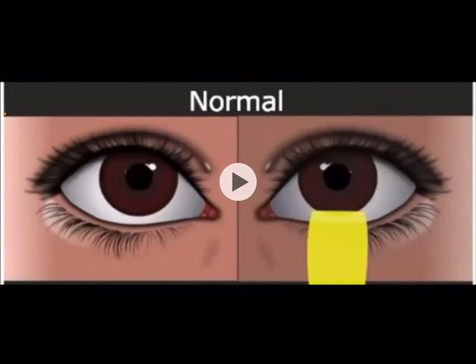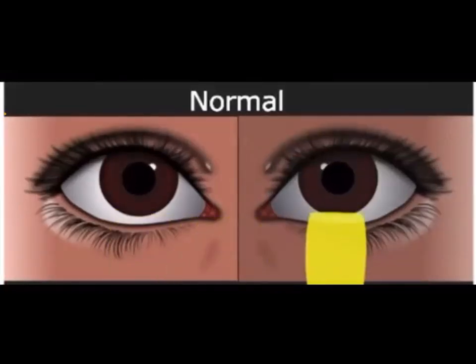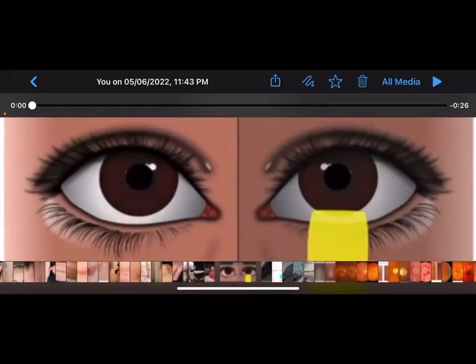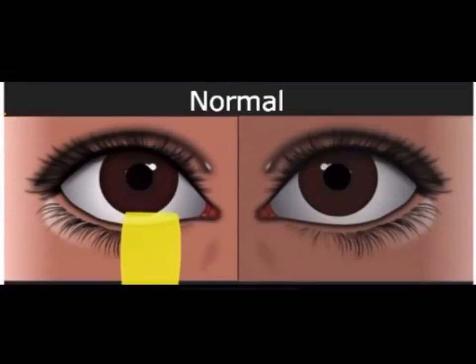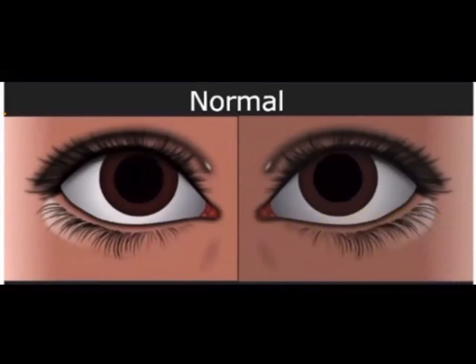I don't know if you can see my screen. I will show you the afferent pupillary defect or the swinging light test. This is the normal. Whenever you shine the light, both pupils will constrict, right? I will repeat again. Are you able to see my screen? Yes, sir. So now the light in the right eye, right? Focus on the reaction of the pupil whenever the light is shone on the pupil. See? Constrict. Constriction again. Okay. This is normal.